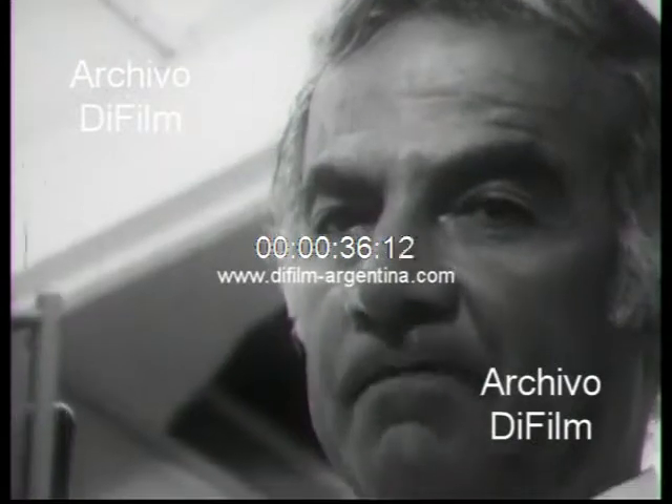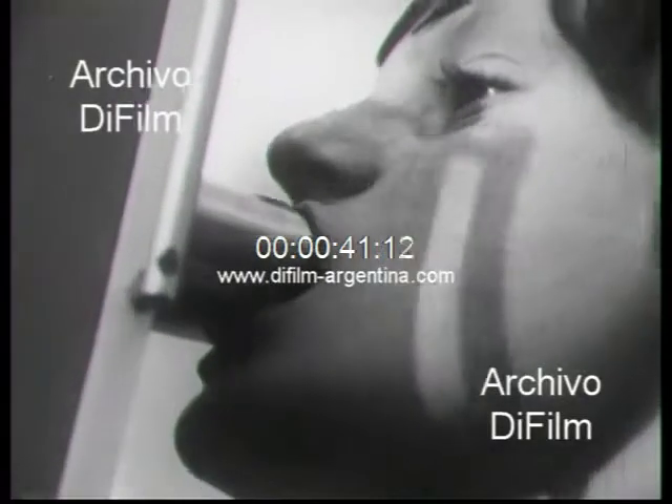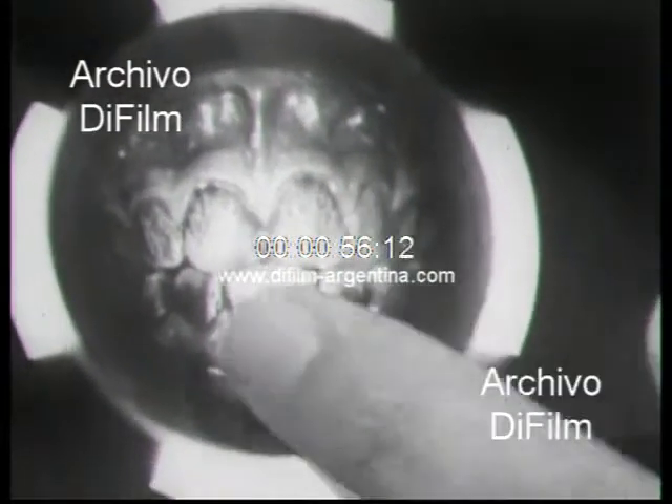Now, in this demonstration, two Polaroid photographs of the young boy's mouth are made. The first was shot with normal light, the second with ultraviolet light. The normal light photograph shows a set of reasonably clean, healthy teeth. But the ultraviolet photograph shows very heavy deposits — the sticky, bacteria-filled substance known as plaque.